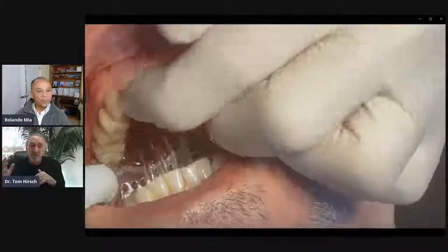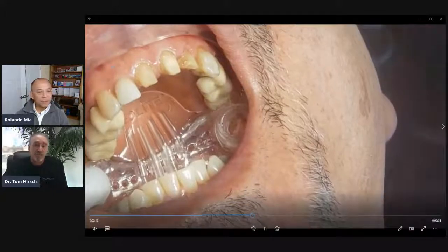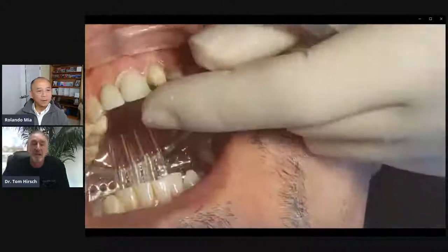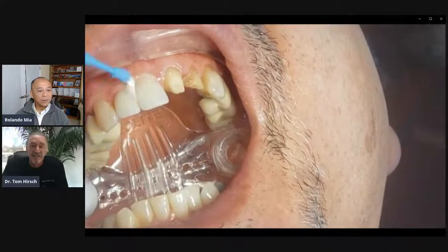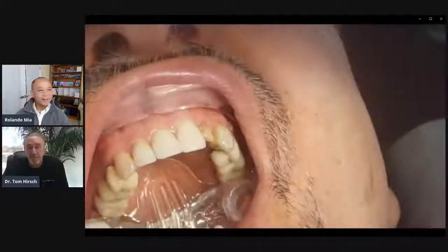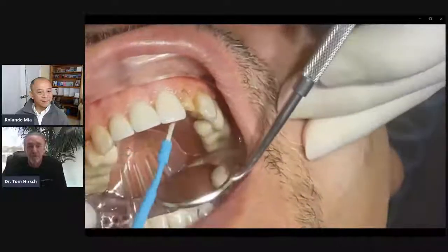Now we're getting ready to place the crowns. We tried them in, adjusted the contact, checked the occlusion — all that. We bonded it and we're seating the crowns now. I like to seat them one at a time, not cure them, but seat them one at a time. The product I use for this is called Ensure, and it's totally light cured — not a dual cure resin cement, cured by light only. That way I've got all the time I need to clean up the cement and floss, without having to worry about rushing for a time set at all.